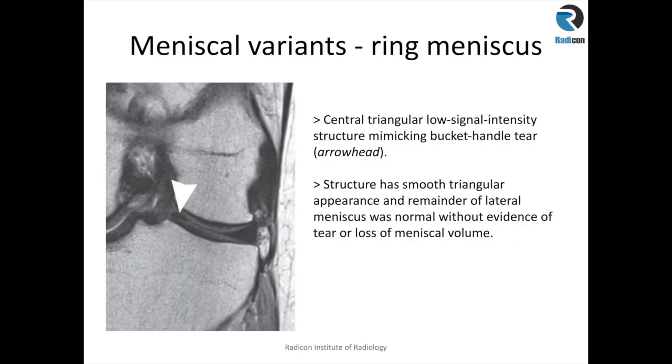Another meniscal variant is a ring meniscus, where you get a central triangular low signal intensity structure which may mimic a bucket handle tear.